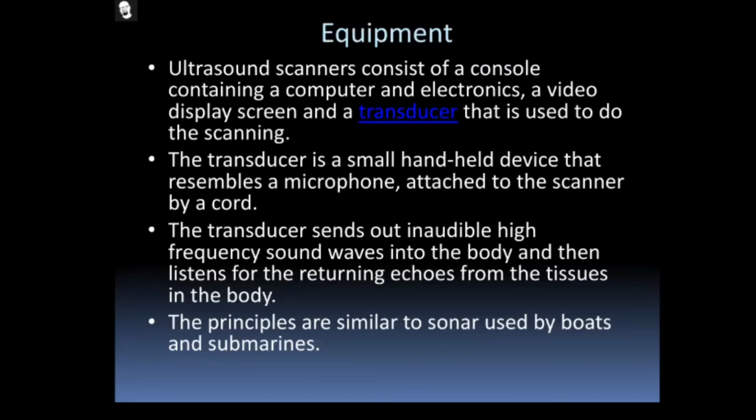you need to say this is a kidney, this is a spleen, this is the liver. That is especially important for the application specialist, those who are responsible for giving demos to the doctor, because the doctors are experts in anatomy. So if you want to give a demo to the doctor, whatever you are seeing in the monitor, you must tell exactly that particular part to the doctor.